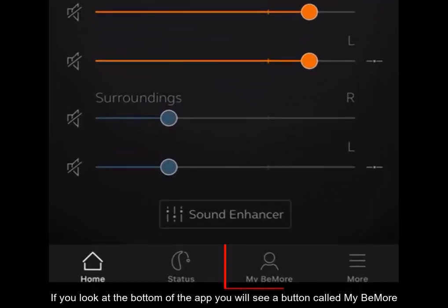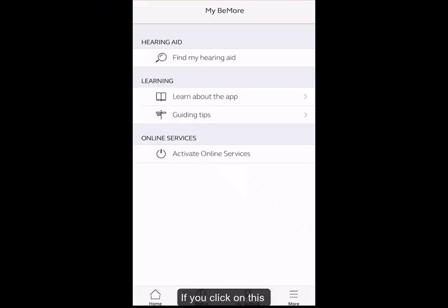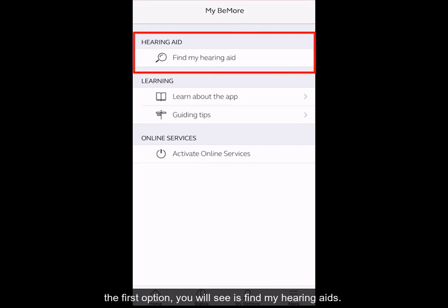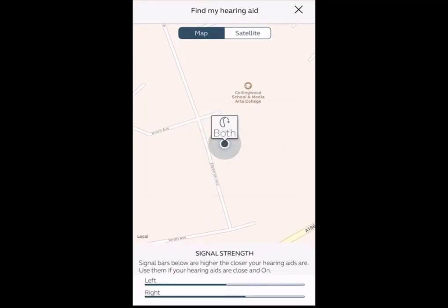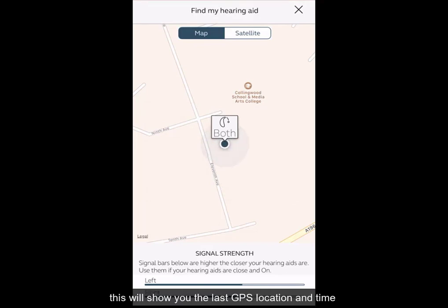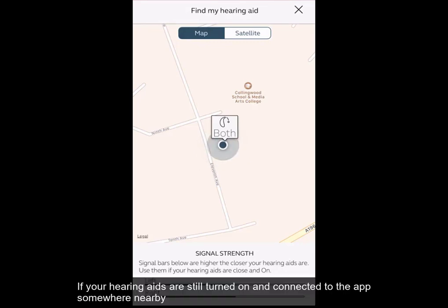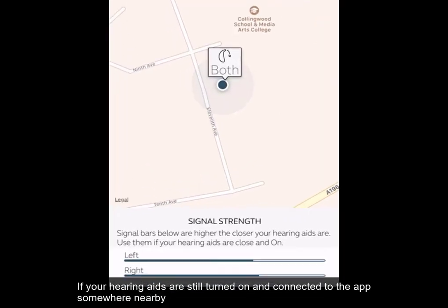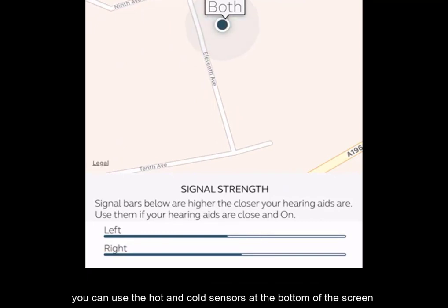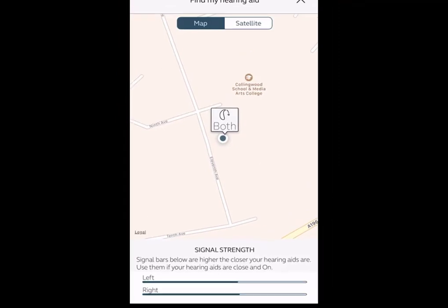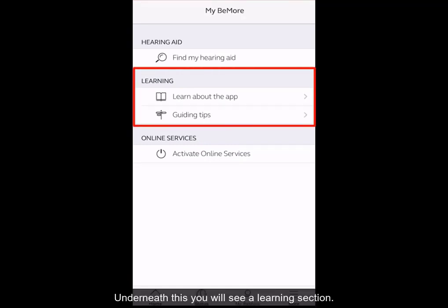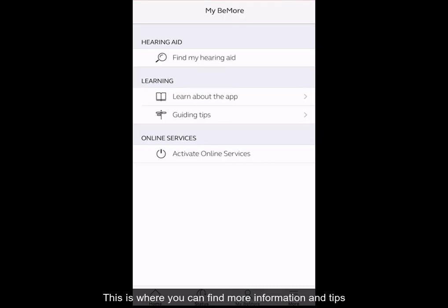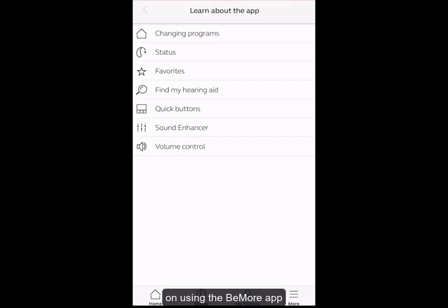If you look at the bottom of the app, you will see a button called My Be More. If you click on this, the first option you will see is Find My Hearing Aid. If you click on this, you will see two different options. The first is a map — this will show you the last GPS location and time that your hearing aids were turned on and actively connected to the Be More app. If your hearing aids are still turned on and connected to the app somewhere nearby, you can use the hot and cold sensors at the bottom of the screen to find your hearing aids. If you then click on the cross in the top right hand corner of the screen, you will come back to the menu. Underneath this, you will see a learning section, which is where you can find more information and tips on using the Be More app.